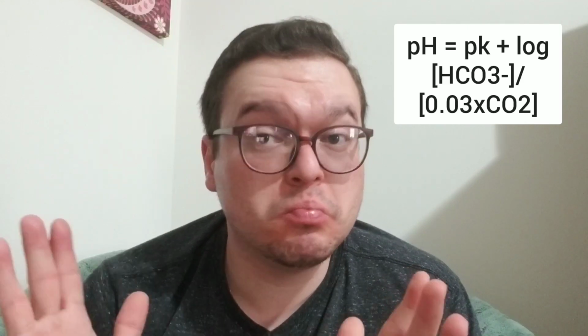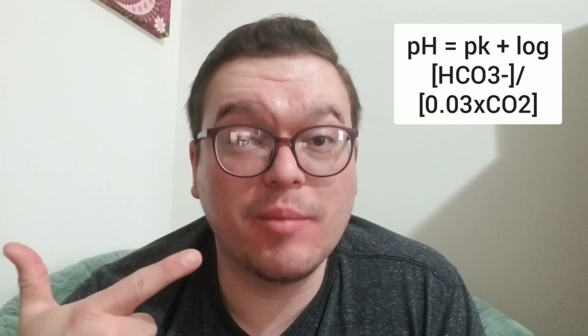Now, the reason I didn't mention it is because in an ABG, this is actually a calculated value, not an actual measured value. What do I mean by that? If you remember the Henderson-Hasselbalch equation, it has to do with the pH, the carbon dioxide, and the bicarb being in a constant balance in between. In the case of an ABG, it will measure your pH and it will measure your PCO2. The problem is that it just backward derives your bicarb.